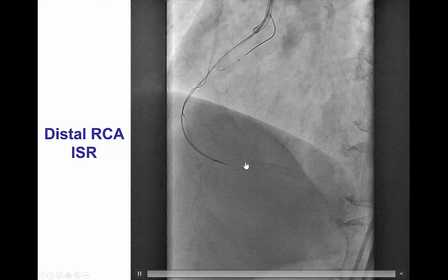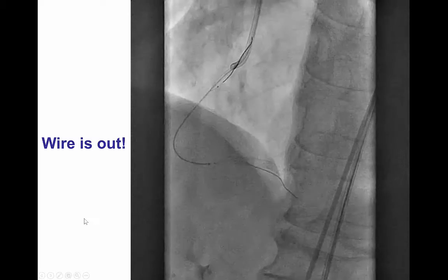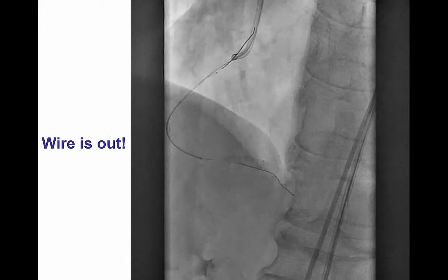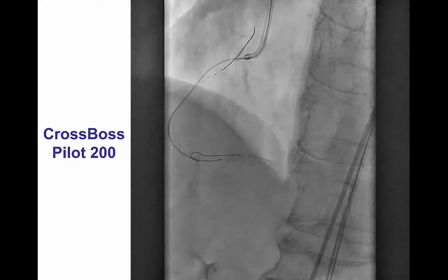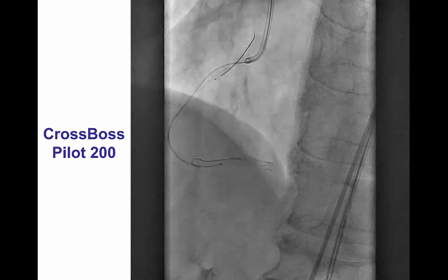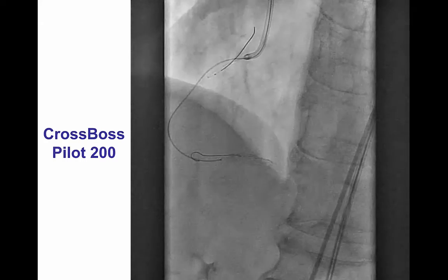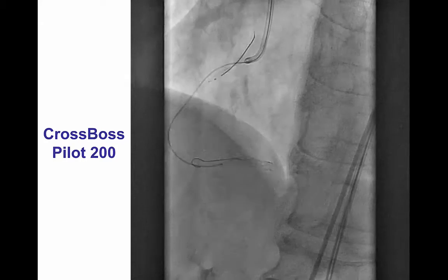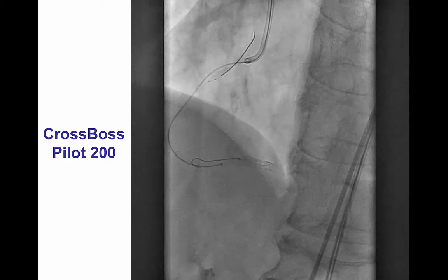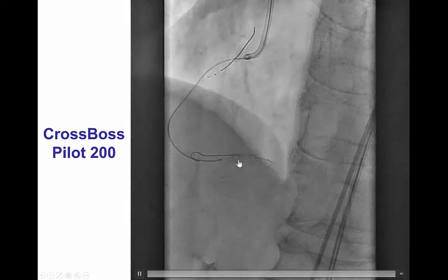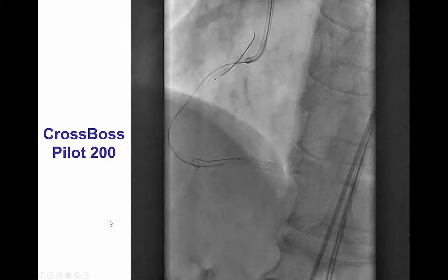However, we then reached the distal RCA proximal to the previously placed occluded stent. It was very hard to wire past the occluded stent — we tried to advance a wire through but that was not feasible. Eventually we elected to go around the previously placed stent, given that we were already in the sub-intimal plane. We used a Pilot 200 guide wire, and with significant difficulty and forceful pushing, we were able to advance the knuckle around the previously placed stent.